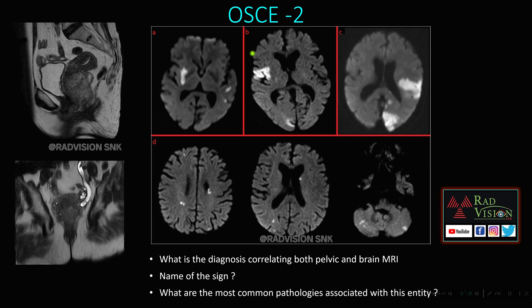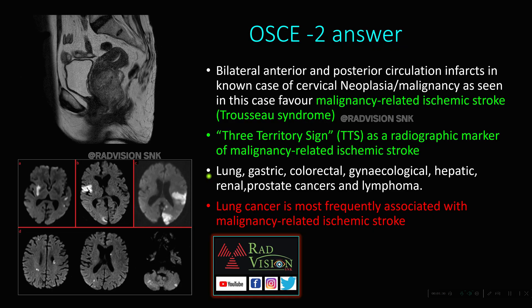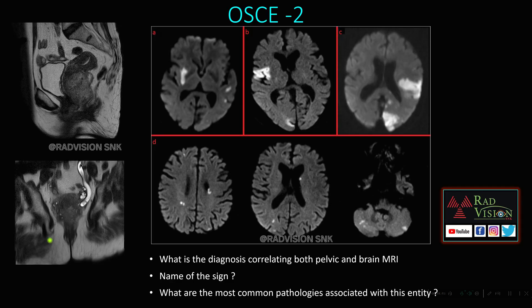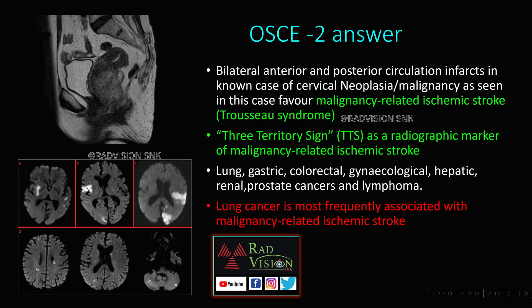Next, OSCE 2. You can see this is an MRI pelvis and this is an MRI brain. What is the diagnosis based upon features in both pelvic and brain MRI? What is the sign and what are the common pathologies? Here you can see there is a heterogeneously T2 hyperintense signal mass lesion noted in the cervix with extension to adjacent structures, partly extending to the parametrium, and also infiltration into the left vaginal wall with left hydronephrosis — suggesting a neoplastic mass lesion arising from the cervix.